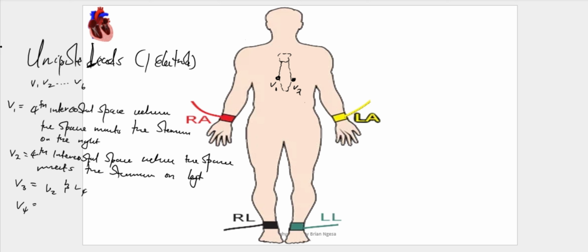This is normally placed at the intersection of the midclavicular line and the fifth intercostal space.